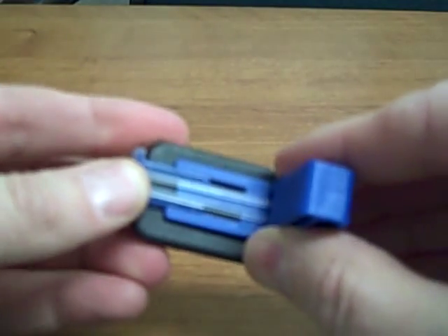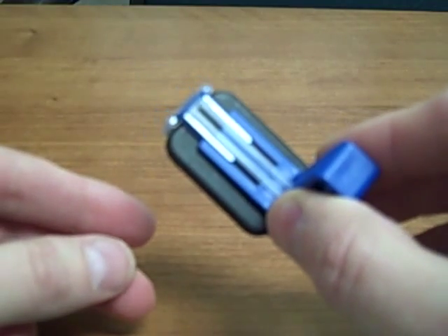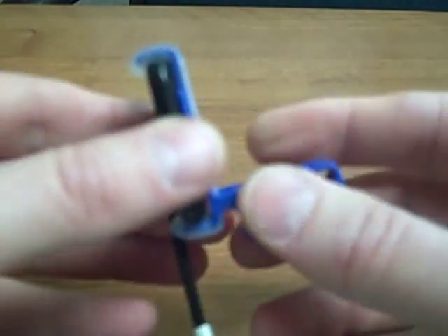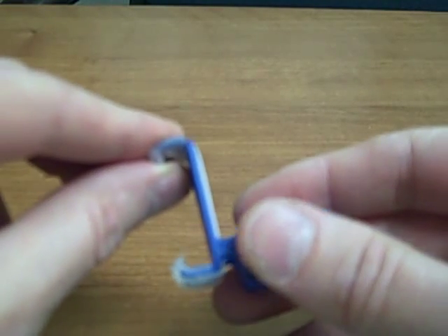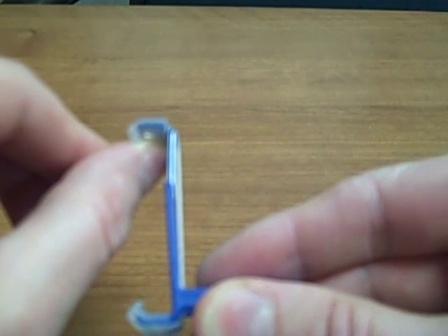This is the anterior bite block, and you can see that it holds the sensor in a vertical orientation. This bite block is universal, so it will hold either a size 1 or a size 2 sensor. The self-adjusting clip can stretch out to allow for the different size sensors.